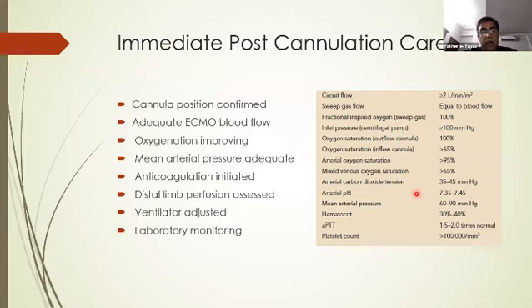And then we definitely do some adjustments to the ventilator, because we don't want to push the ventilators to their maximum, and we just want to relax the lungs, but we don't want to make them lazy.